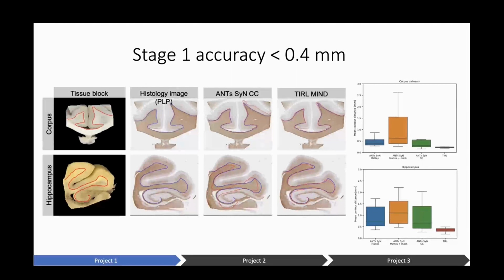If these hemispheres go apart by very large distances, then those kinds of transformations are not covered. So large deformations are not currently covered in my transformation model. All this is small deformations, and for these applications, that used to be enough. But for other applications, when the deformations are large, because hemispheres or gyri move apart from each other, you might need to introduce an LDDMM type of transformation model. Yeah, that's my answer for that.